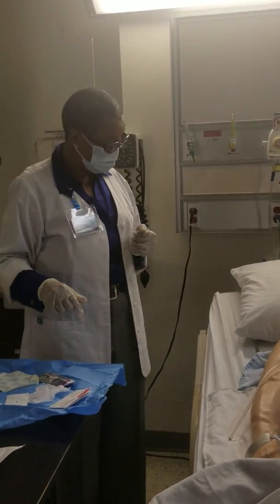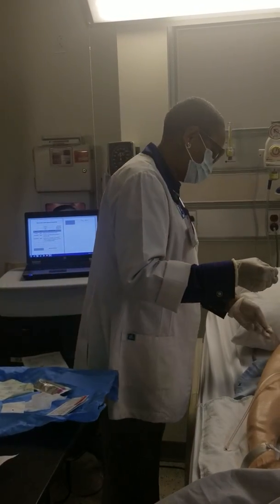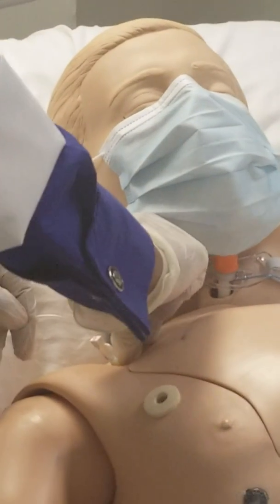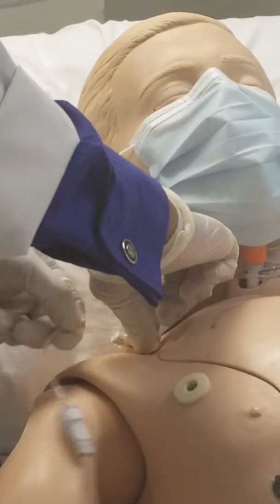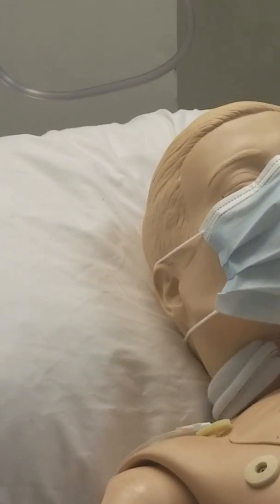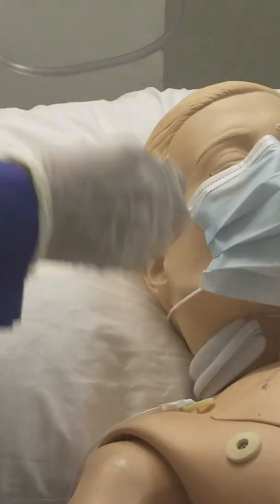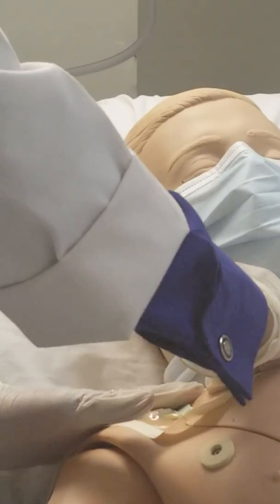What else do you want to do after this? Little thingies. Right. And here it is. So you have to put your biopatch on, and this is going to be a fight to do, but you can do it. You're nursing students, okay? Just watch him so he don't fall out on you, okay? The blue side is up. Blue to the sky. Then you go ahead and put your dressing on. Dang. That's a whole lot easier than the video. Had so many steps.